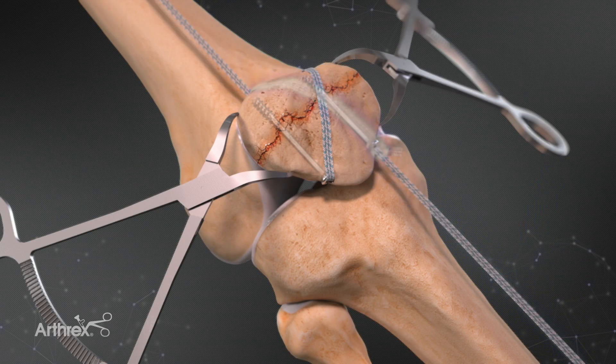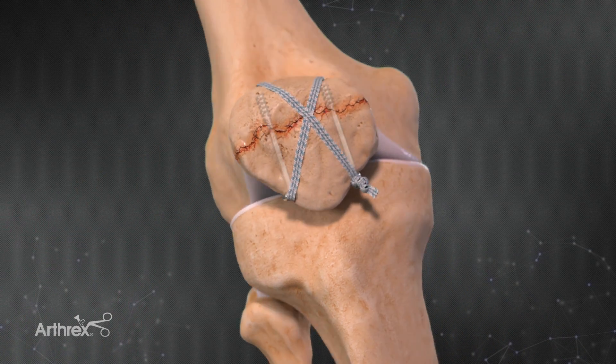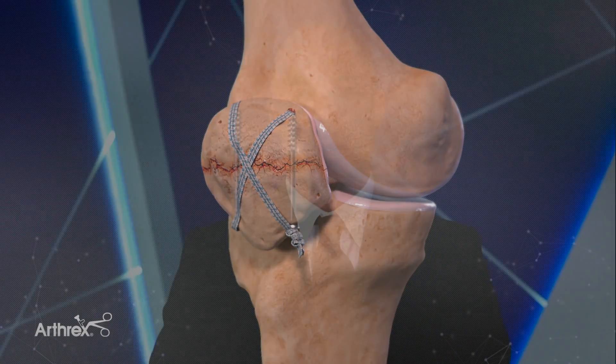The thing I'm most excited about is the fiber tape option. I feel that I'll be using this in other areas of the body as well, to negate the prominence of surgical wires and the breakage of surgical wires that we frequently see.